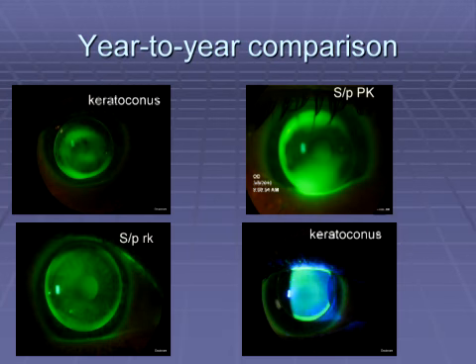It is also beneficial to document each specialty RGP patient with a simple still photo for year-to-year comparison. If problems arise, it is simple to compare present-day fit to prior photographs. While saving and organizing video clips would be cumbersome, still photographs are easily saved in most EMR systems or printed for the hard record.